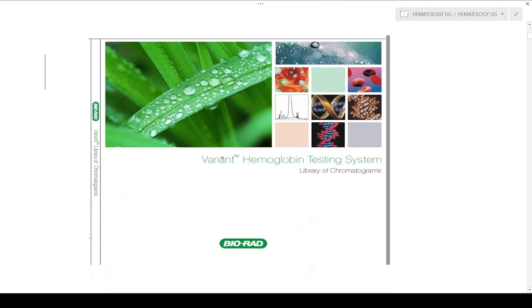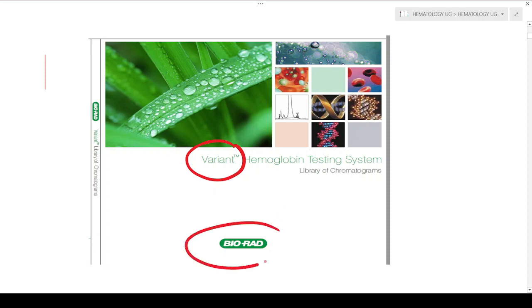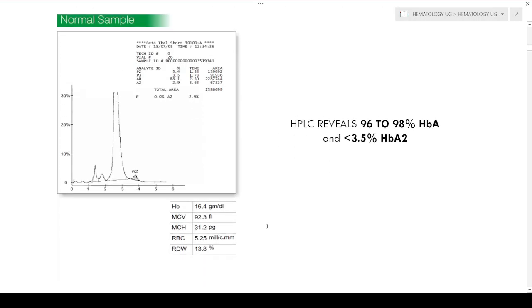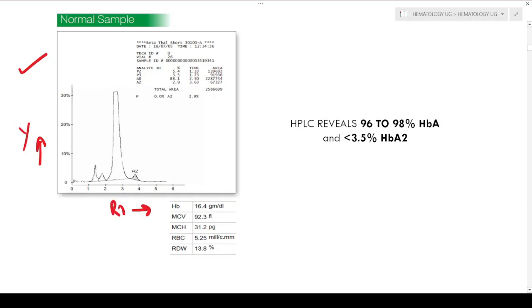The charts I am going to show you are from the Variant Hemoglobin Testing System — the library of chromatograms from Biorad. I will also show some personal charts from my college. First, we should understand how a normal adult sample looks. In the HPLC chart, the percentage of the analyte is on the y-axis and the retention time is on the x-axis.